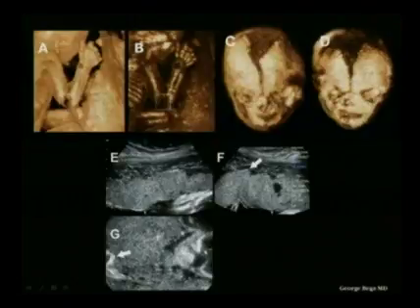So as a rule, you should not base your anomalies on one single volume. It is likely it can be an artifact. As a recommendation, more than one volume has to be acquired to really cross-check the presence of an anomaly.